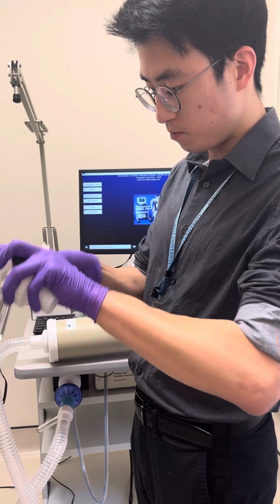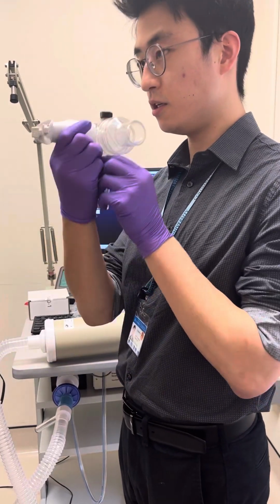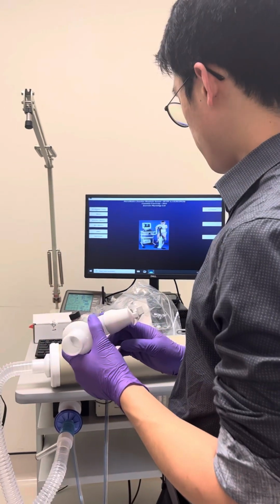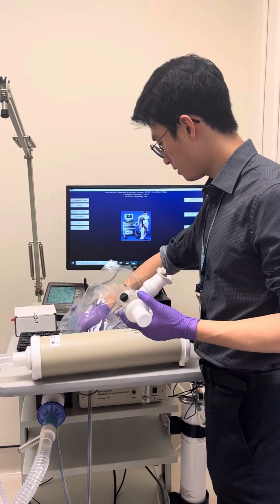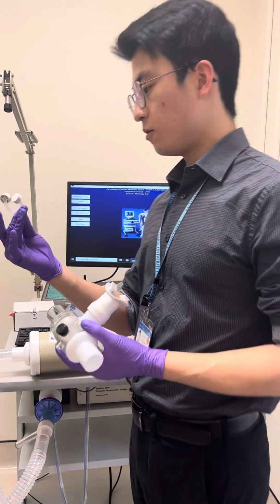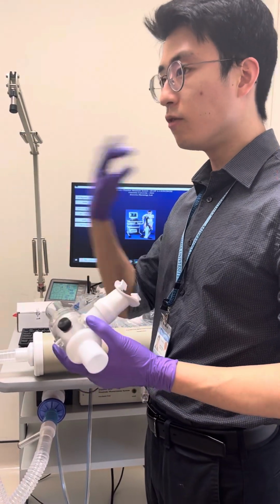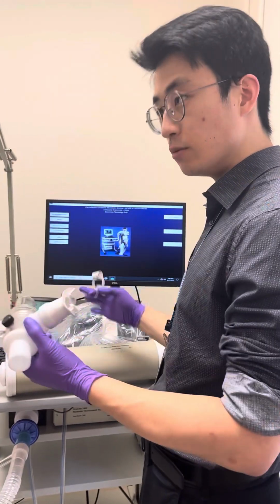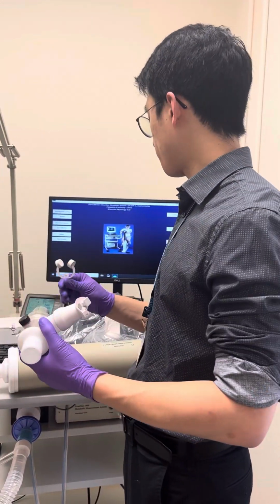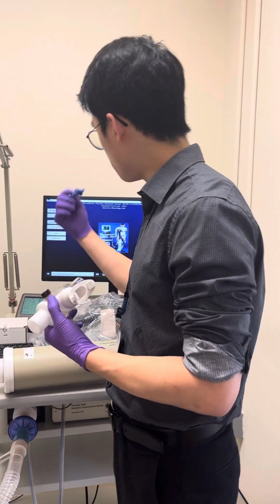Yeah, so when you put it on, just make sure that it's horizontal level with the patient's mouth. And the last thing you're going to need is a nose clip. So this is basically to ensure that all of the breathing goes into the machine, and you're not breathing through your nose. These are the ones that come with the machine.